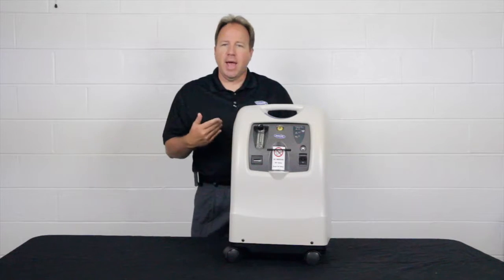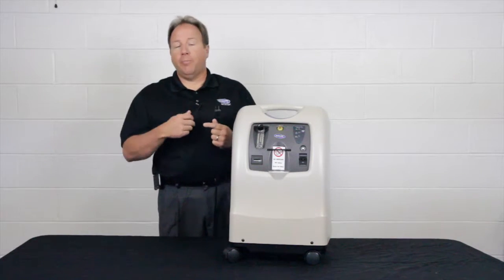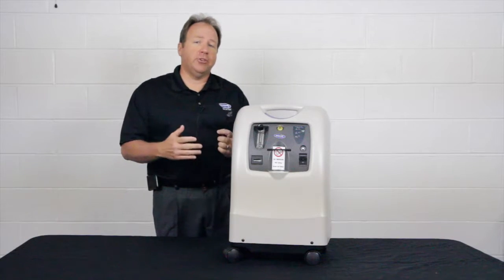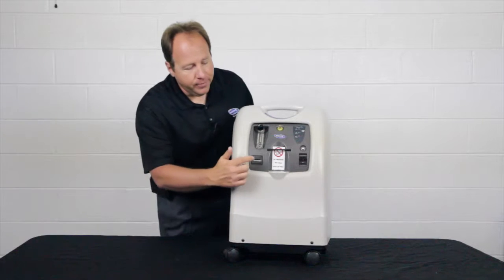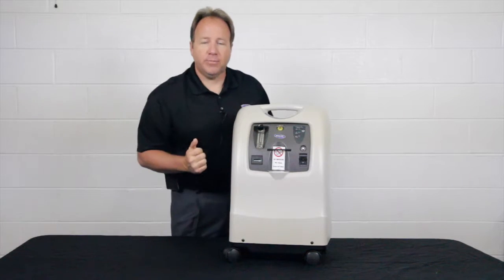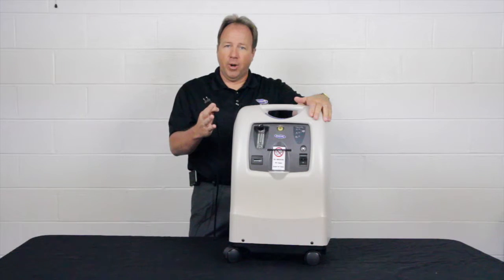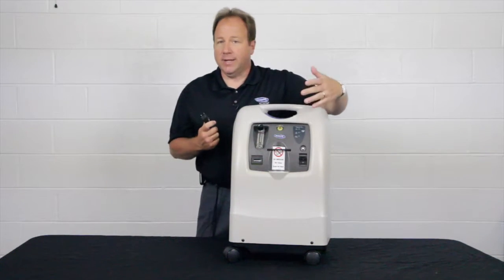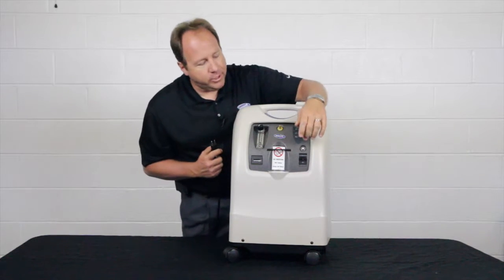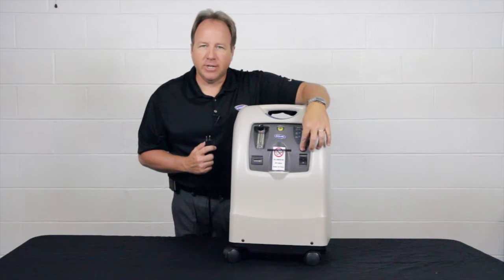The third thing is you might have a power surge — maybe lightning, or your local utility company has a power surge that goes on and off — and it may blow the circuit breaker right here on the front of the machine. So you may be getting your power loss beeping, but the unit — you turn the switch off, turn it back on — it's still not coming on. What I would do is double check the white reset button right here, make sure it's pushed in.